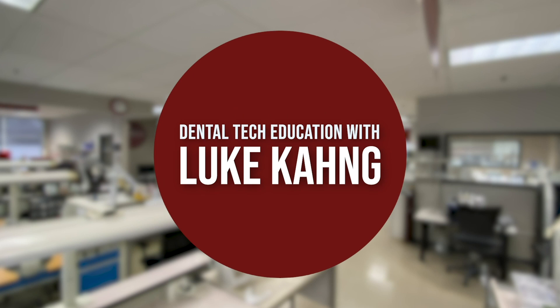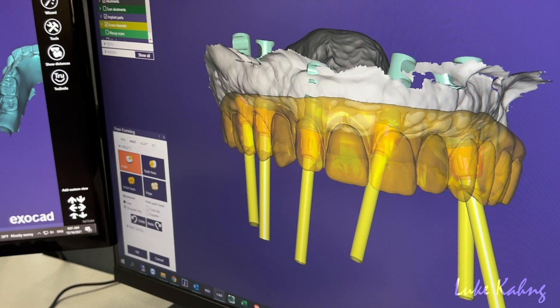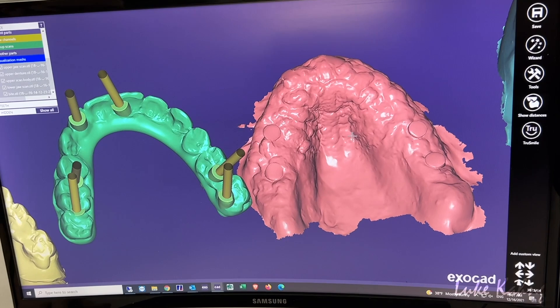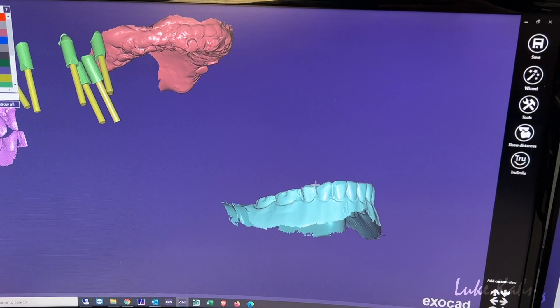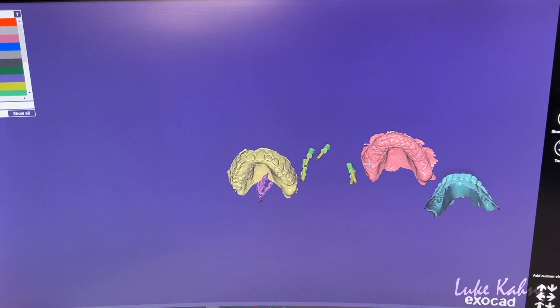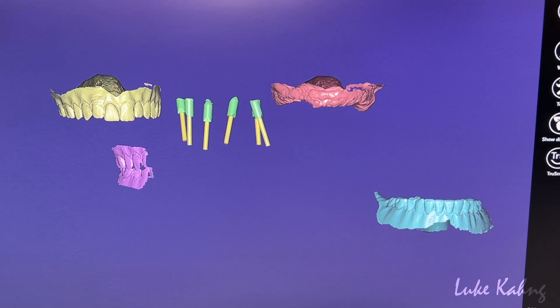First we got the cases from the STL file or physical impressions. From the STL file, we received three different scans: the first is the jaw scan, one of the PMMA, the bite scan, and the opposing. We had to mesh these two together, and once those were matched we could mesh the bite to that, then match the opposing.